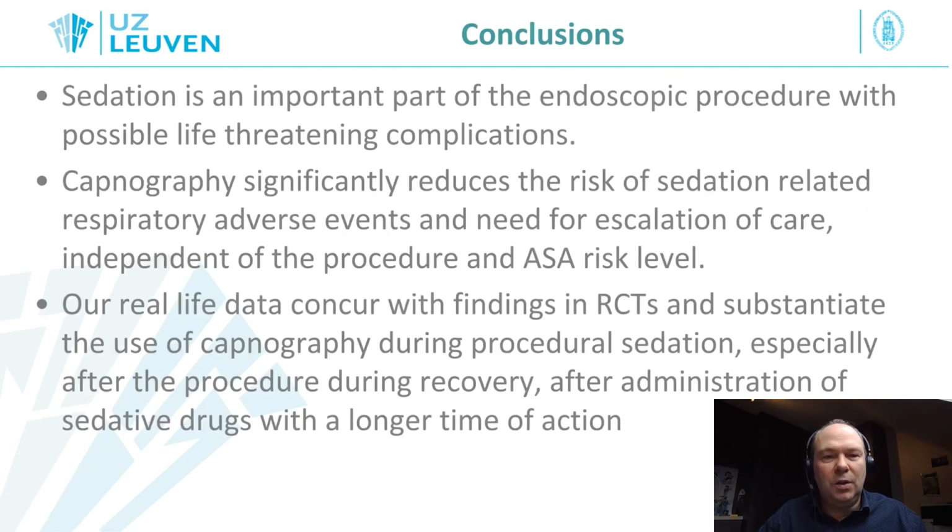So in conclusion, sedation is an important part of the endoscopic procedure and has possible life-threatening complications associated with it. And capnography significantly reduces the risk of sedation-related respiratory adverse events and the need for escalation of care. And this was independent of the procedure and the ASA risk level.